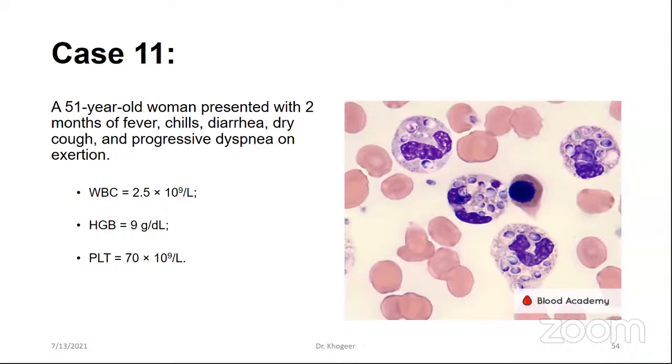How common is it to see lymphoplasmacytoid cells in the COVID patient? Sometimes, yes, because lymphoplasmacytoid cells are a kind of morphological alteration in the lymphocyte that correlates with infection, especially viral infection. Again, COVID patients usually present with lymphopenia, so it's hard to find a good number of lymphocytes to go through them and examine their morphology thoroughly.